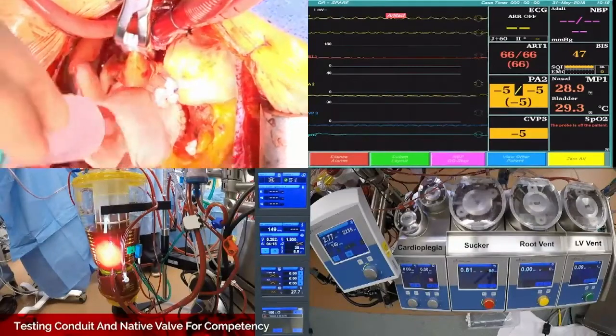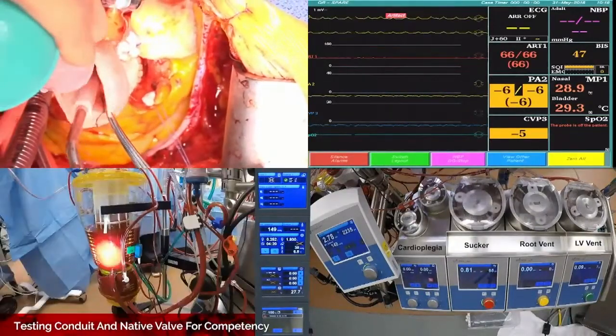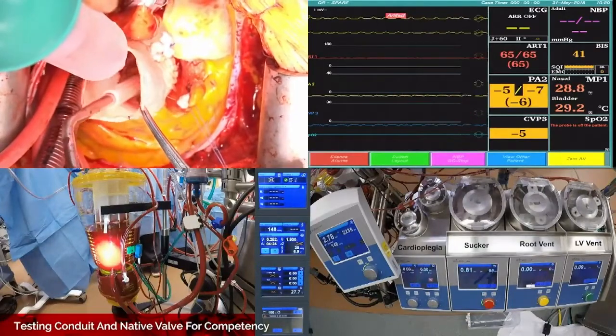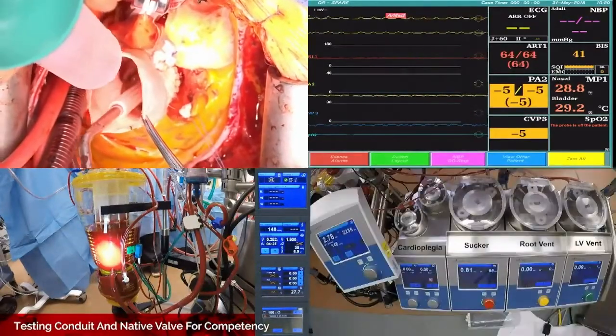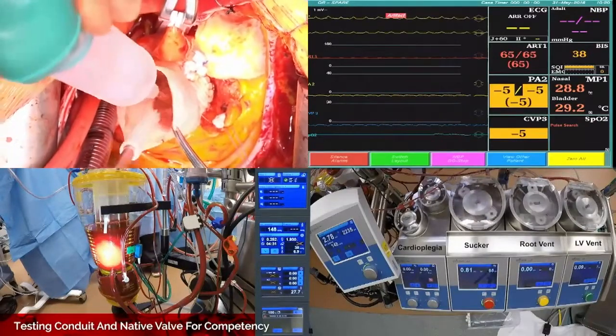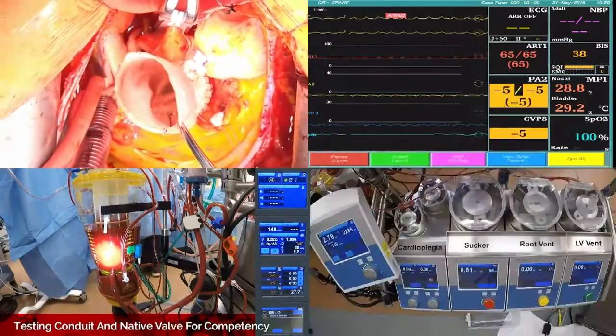Well, since I scrub, I see it. But when you're not assisting, if you're in the back, though, yeah, I'm talking about that view down the hole. I would say only two people in the room, generally speaking, are going to have that view, unless they have cameras and somebody's focusing it.